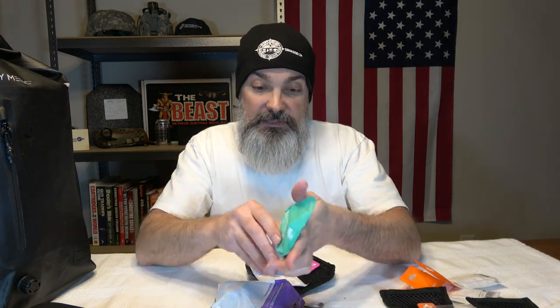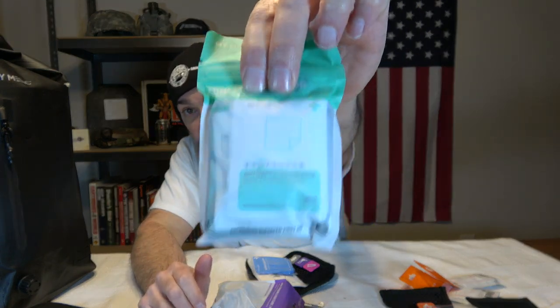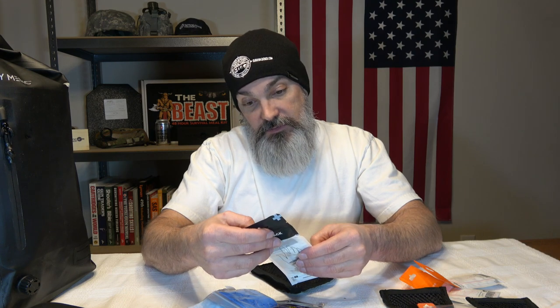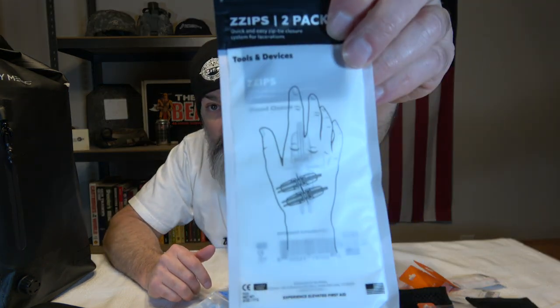Then we have a mini topical kit that has two antiseptic wipes, hand sanitizer, triple antibiotic ointment, a lip balm, a sunscreen, some hydrocortisone for anti-itch, oral pain relief, and some chafing cream. Man, a lot of stuff squeezed into this little pack. We've got some nitrile gloves — I'm assuming one pair. And then we've got some zip closure sutures: two zip devices and one zip IFU — I'm not familiar with that term, but these are just closures. It's a two-pack.